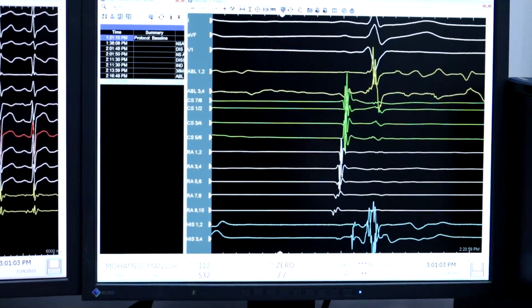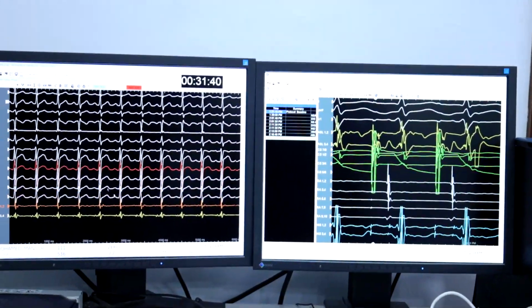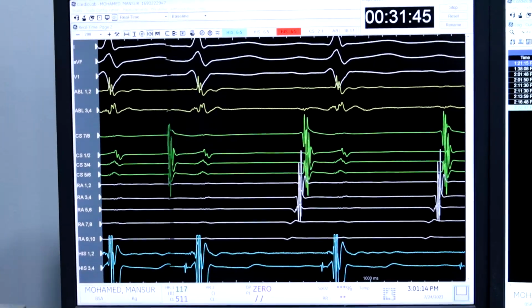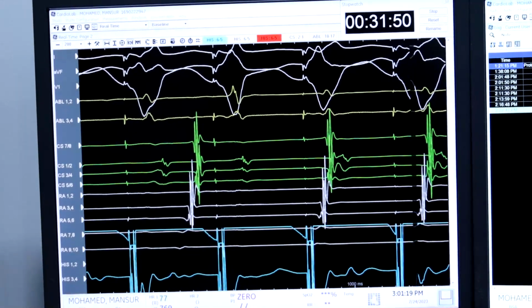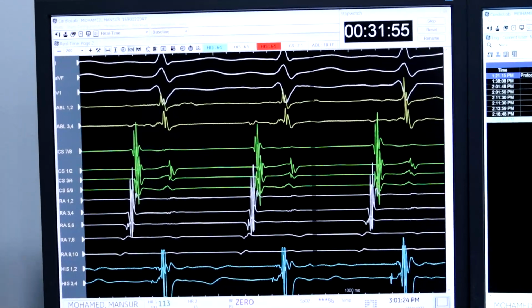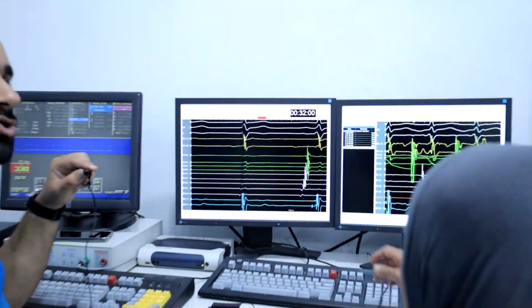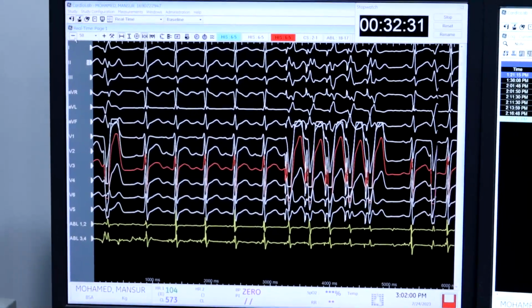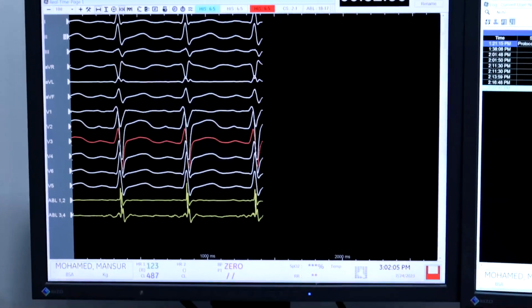After the effect of isoprenaline, go to intracardiac, go live. Pace from the His. Now we also have VA dissociation, still. This is the post study, and we have VA dissociation till the end, and no induction of atrial tachycardia at all. Keep pacing at least half. We do it like this, pace.